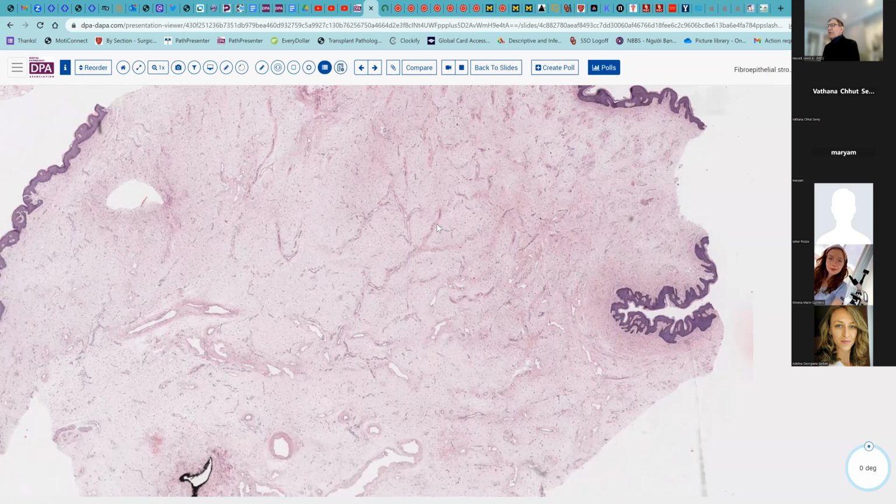So at this point, I want to come back to the questions that you've raised, and that will probably take us back to some of the issues that we talked about with regard to differentiating gastric type carcinoma from endometrioid carcinoma. So the gastric type carcinomas will not be positive with PAX8. Whereas endometrioid carcinoma is uniformly positive with PAX8.